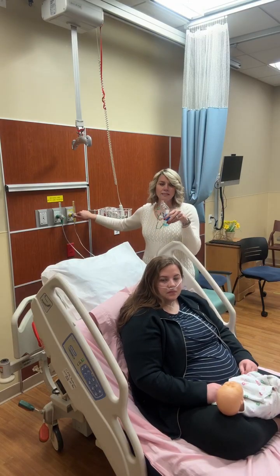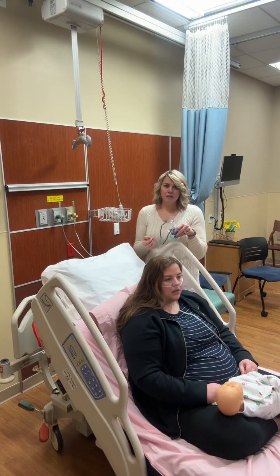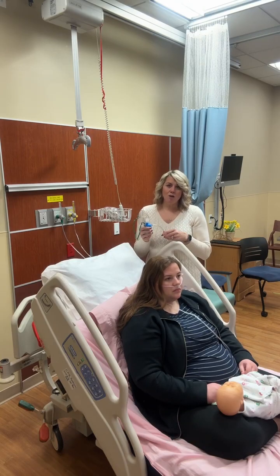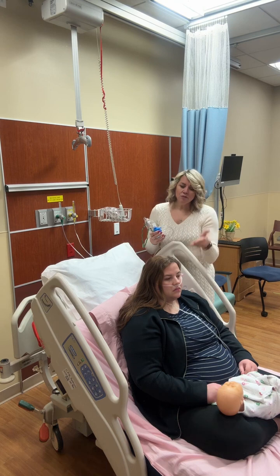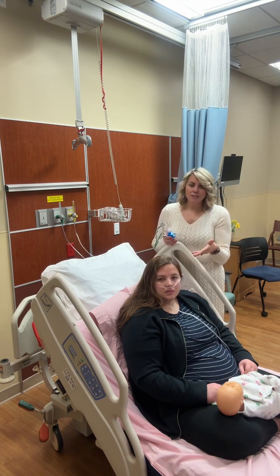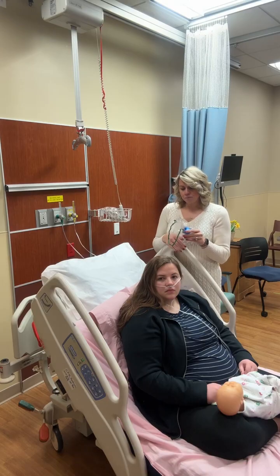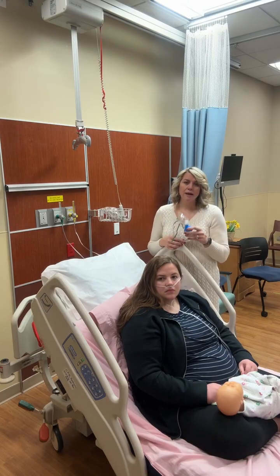Don't ever leave the mask on a patient with nothing coming out of it, because that can frighten them, make them more anxious, and you'd be surprised how long it feels. It feels like forever when you've got something on your face with nothing coming out of it. Even though she's getting the oxygen in her nose, it can still be frightening, and it can feel like you're claustrophobic with a mask on your face.